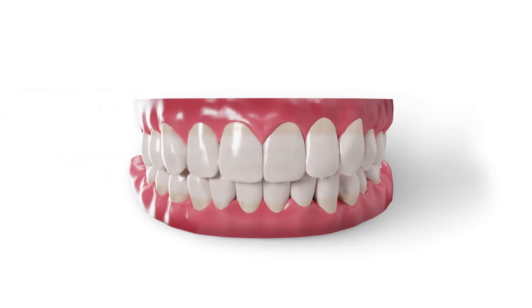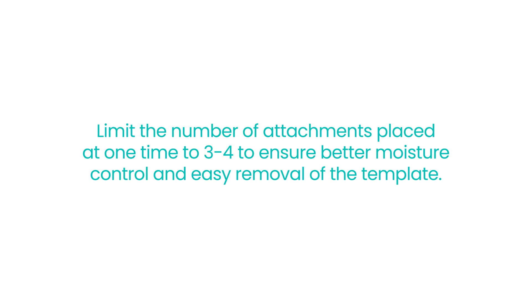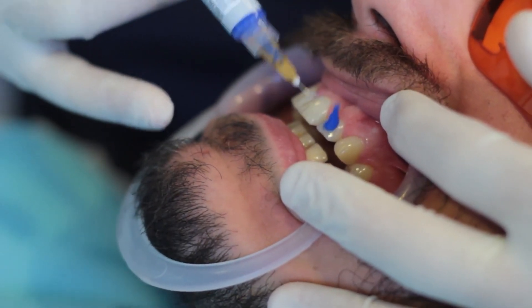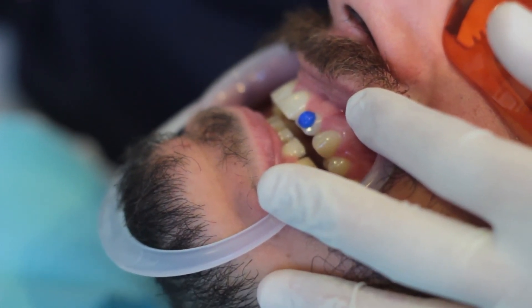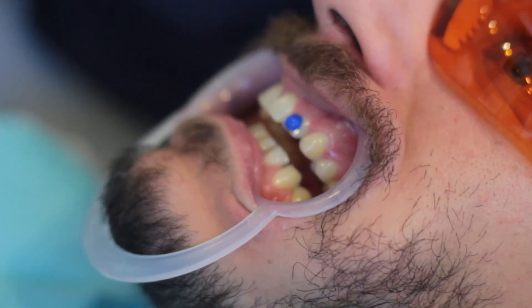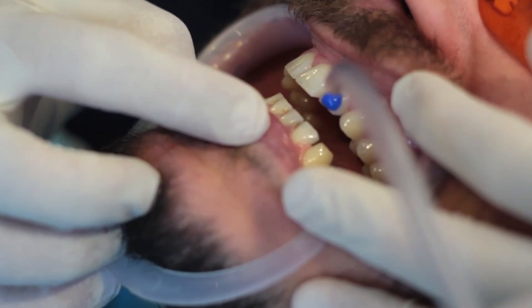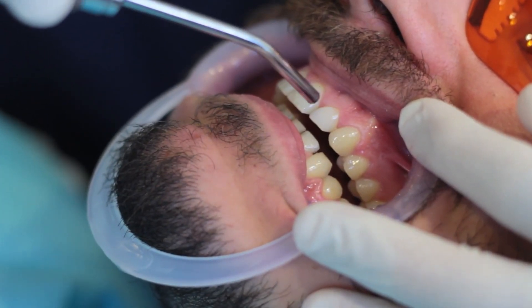It is advisable to place the attachments in quadrants or sextants — that is, limit the number of attachments placed at a time to three or four to ensure better moisture control and easy removal of the template. Next, we apply phosphoric acid for 30 seconds to etch the area and create a suitable surface for bonding. Be careful not to etch the entire tooth surface, but only the area where the attachment will be placed. After that, we rinse for 30 seconds and dry the area until a frosty appearance is visible.